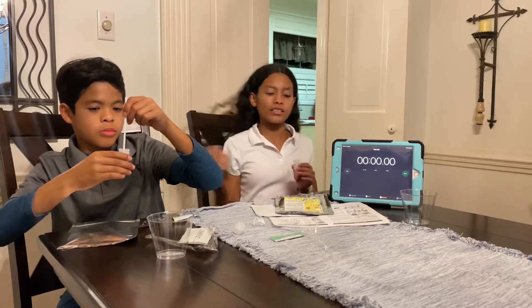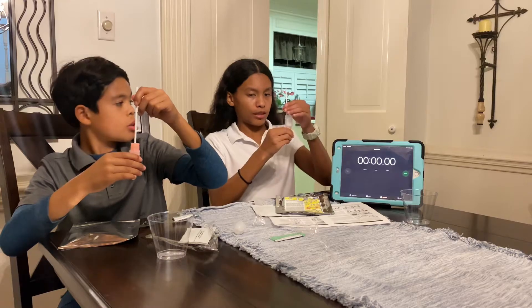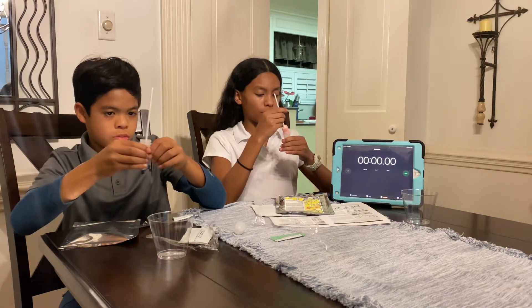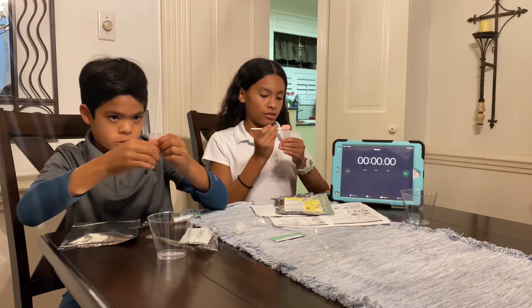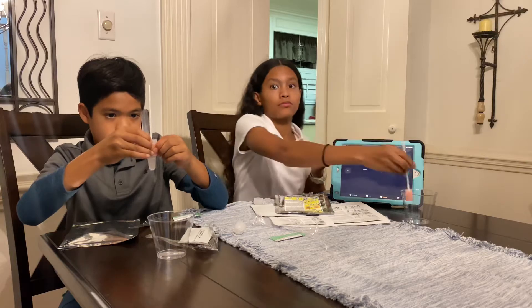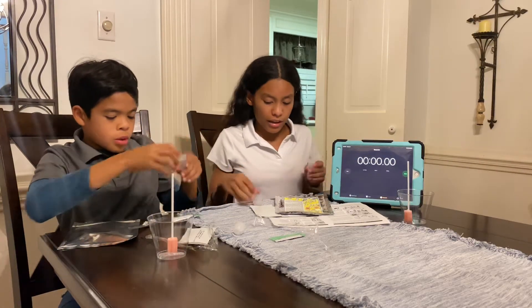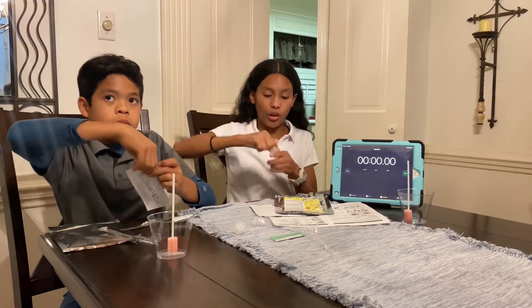Once the one minute is up, you want to squeeze the sponge and take it out, then drift it across the side so nothing will drop out.